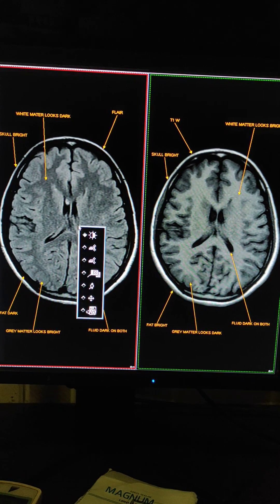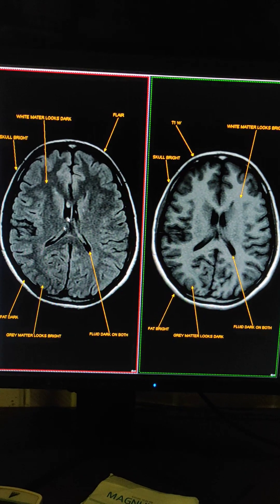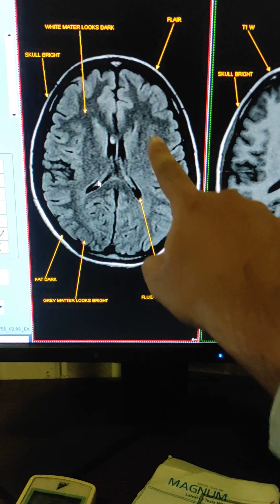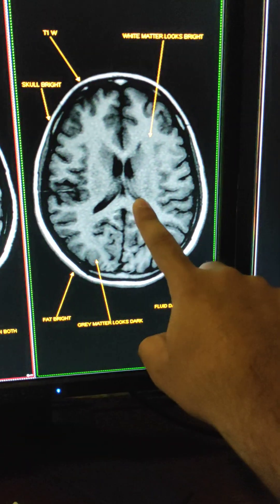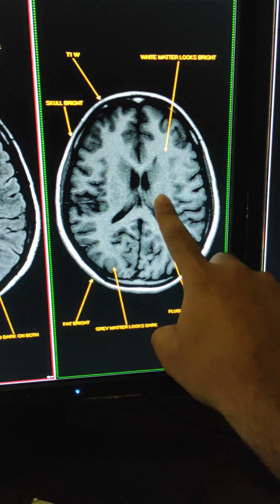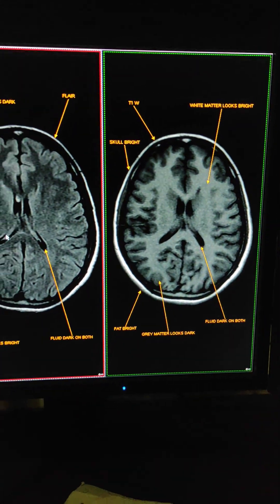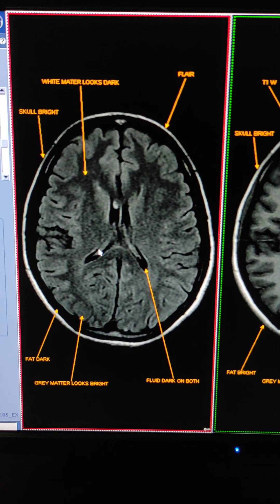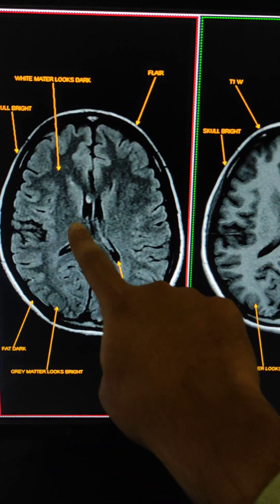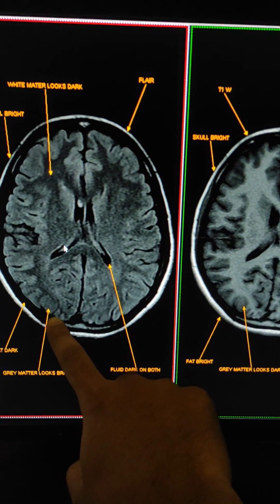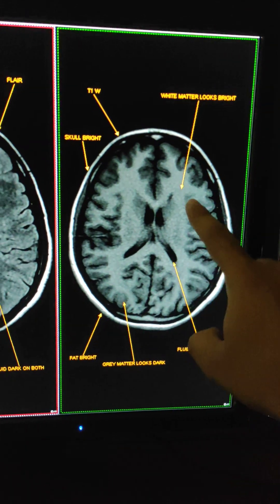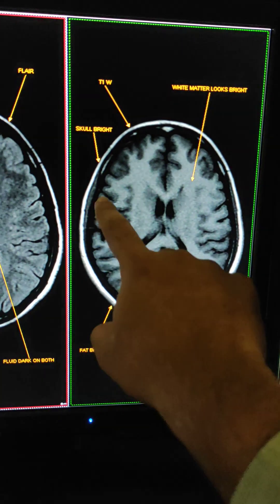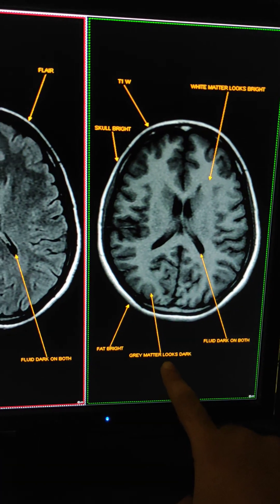Now you have to differentiate between white matter and gray matter. In FLAIR sequence, white matter looks dark, and gray matter looks bright — white matter is dark, gray matter is bright. In T1 weighted sequence, it is the opposite: white matter is bright and gray matter looks dark.